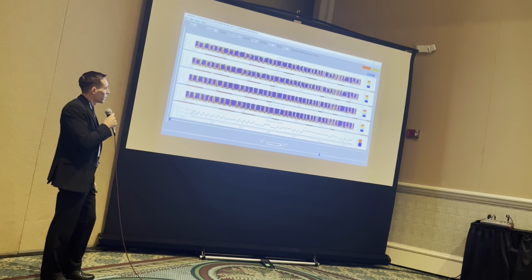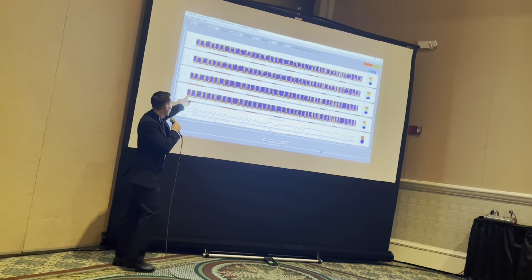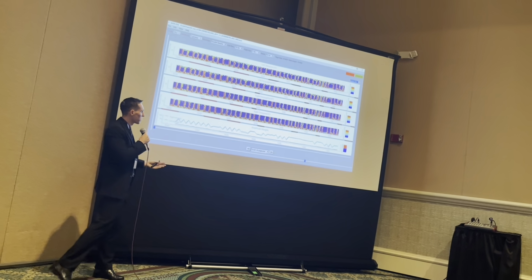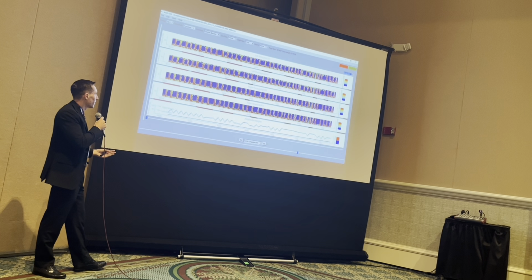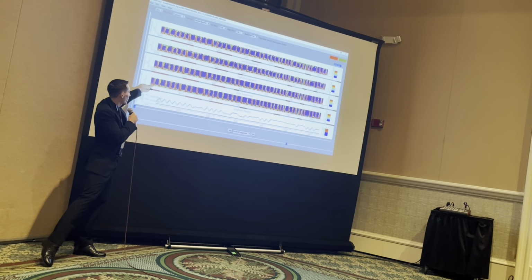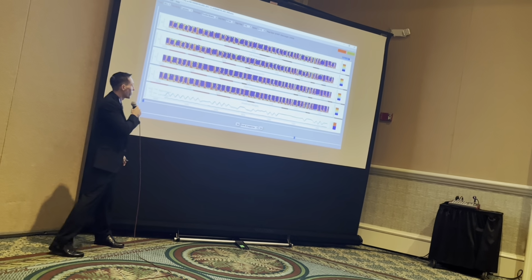Now, in this example, we have what is called vertical stripes. In this patient, it starts out mostly as just delta activity at the bottom, with these stripes that come at almost a regular interval. The kind of pattern shown here is called a burst suppression pattern. So you have essentially completely suppressed slowing and then a high amplitude burst. Suppressed slowing, burst, over and over again.